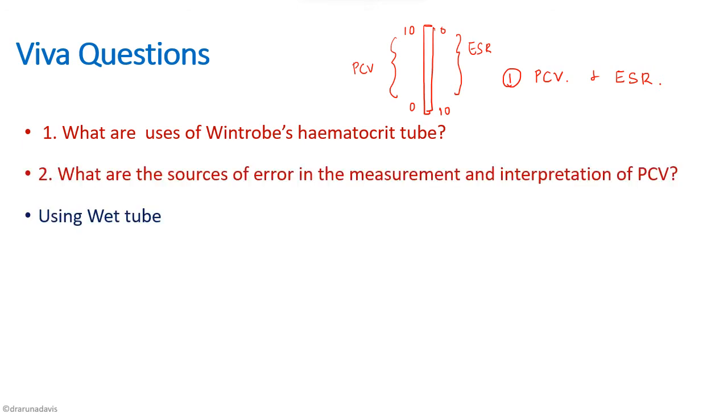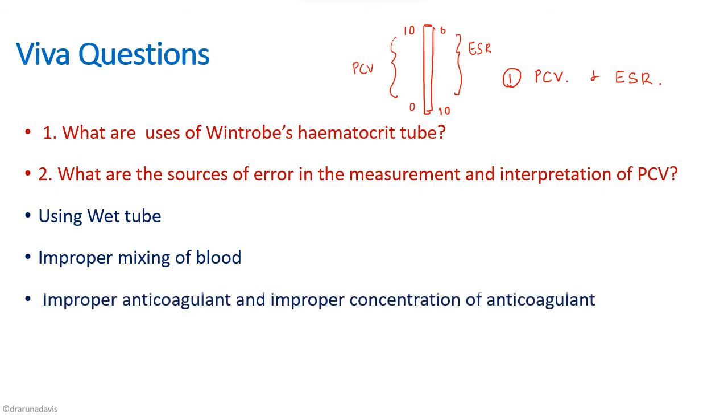The next question is: what are the sources of error in measurement and interpretation of PCV? The first and most important error is that the pipette or Wintrobe's tube should be adequately dry — if wet, hemolysis of the RBCs can occur, leading to faulty results. Another problem is improper mixing of blood; the blood and anticoagulant should be properly mixed before loading onto the tube.